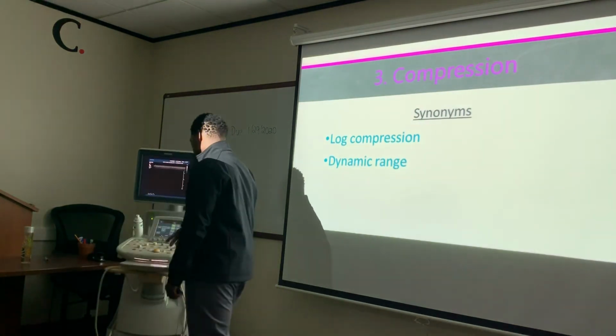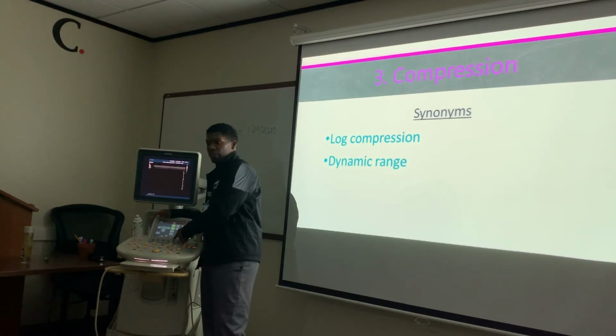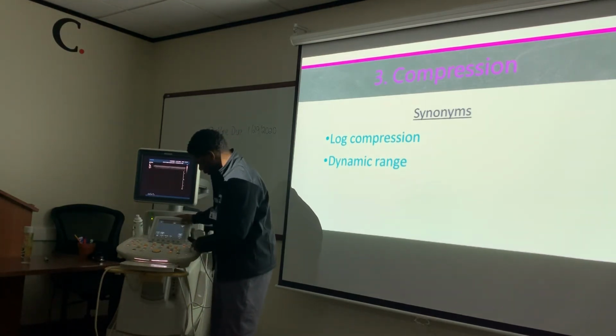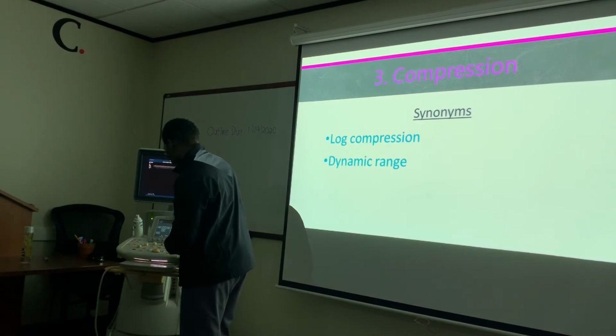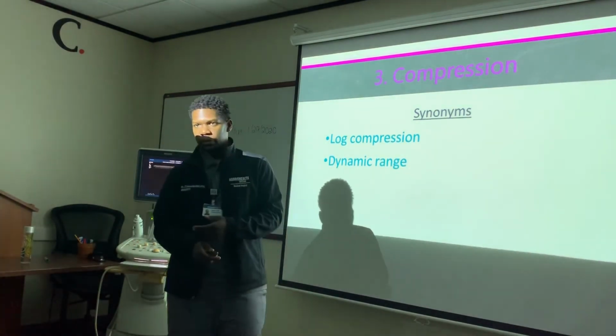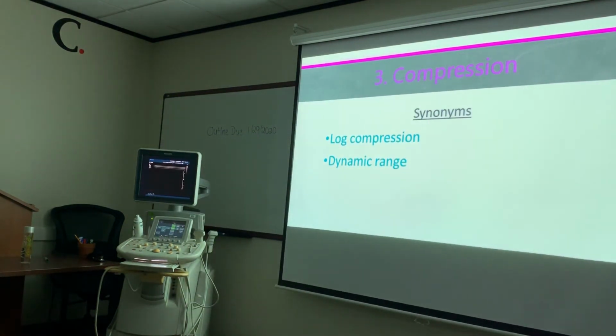Guys, on here, this one has two functions. It actually has compression right there, but it also has what we know as gray maps. Gray maps is another way to adjust your compression. I'll show you in a minute. So compression, log compression, or dynamic range.